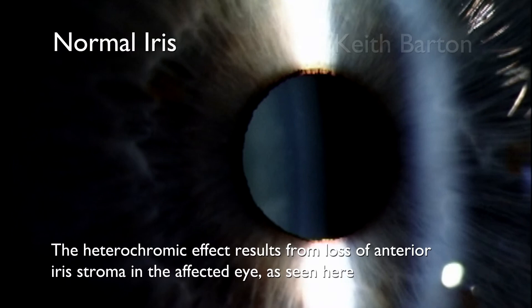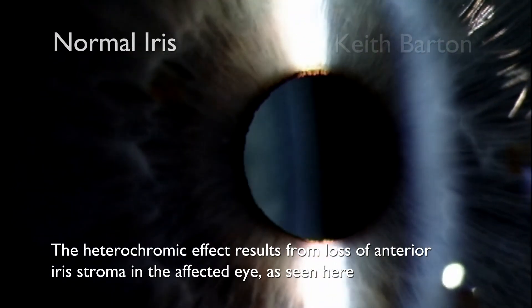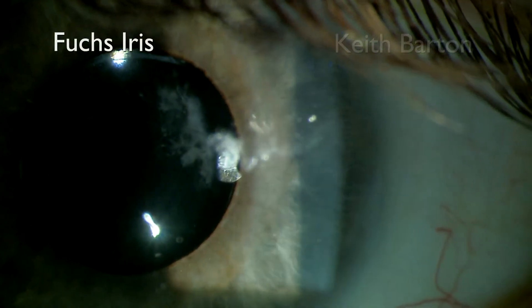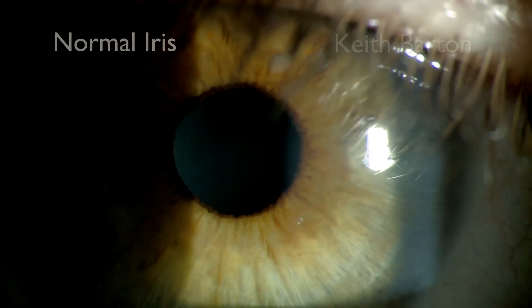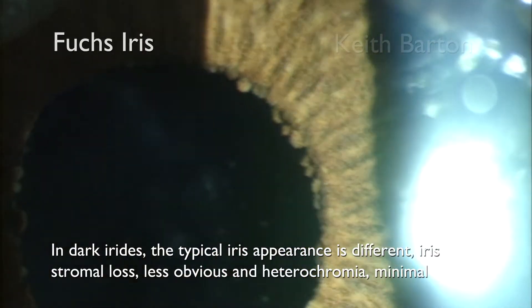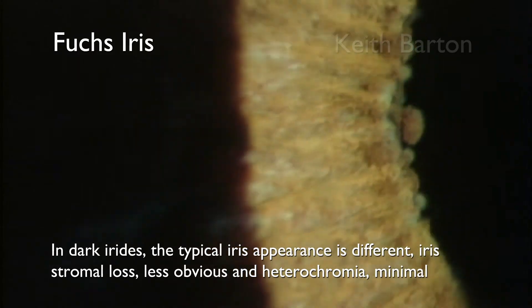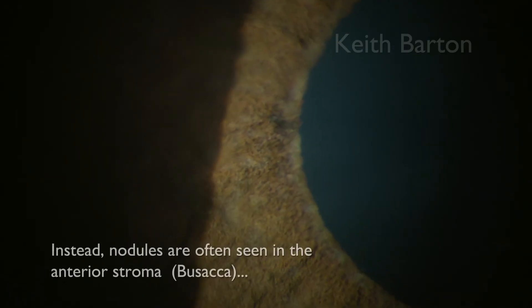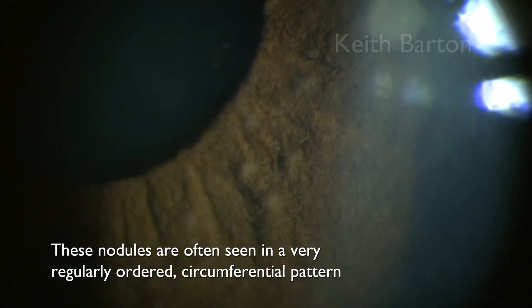The heterochromic effect results from loss of anterior iris stroma in the affected eye, as seen here. In dark coloured irides, the typical iris appearance is different: iris stroma loss is less obvious and heterochromia minimal. Instead, nodules are often seen in the anterior stroma or at the pupil margin, frequently in a very regularly ordered circumferential pattern.